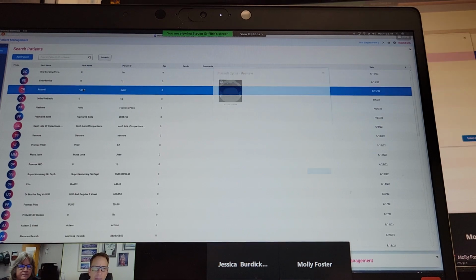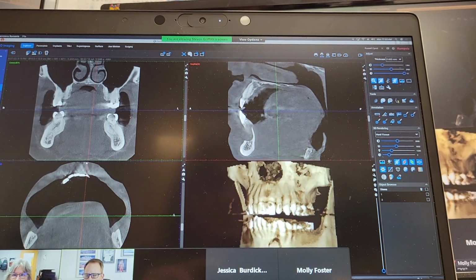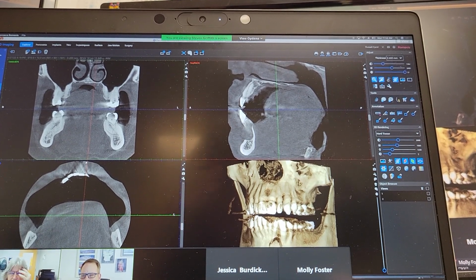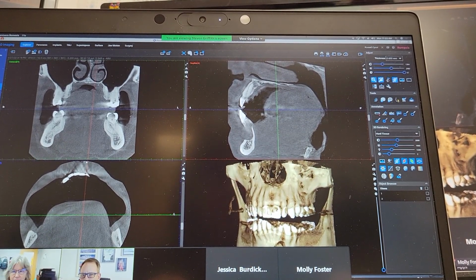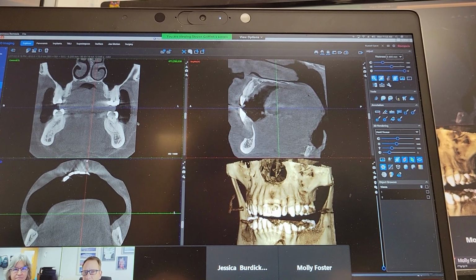Okay. So I'm going to pull up an image. This is one I got up in Ogden, Utah. You guys wouldn't believe it, but the patient came in to the doctor and said, hey, I think I've got perio disease up front. Well, they took the image. No, you've got a giant cyst up front. Wow. That big hole is not supposed to be there. All that missing anatomy is not supposed to be. But if I wanted to make a pan out of this, it will be interesting.